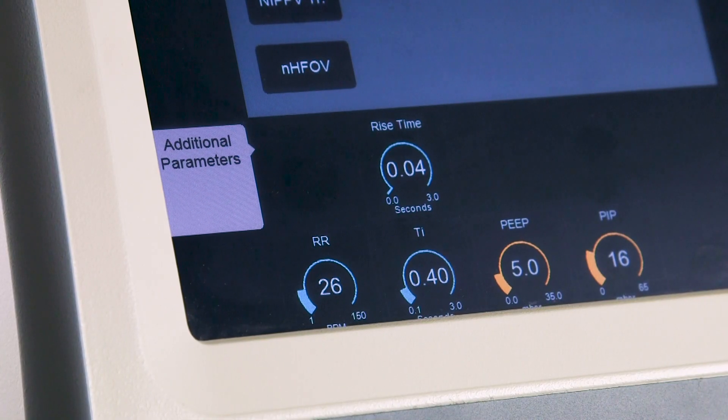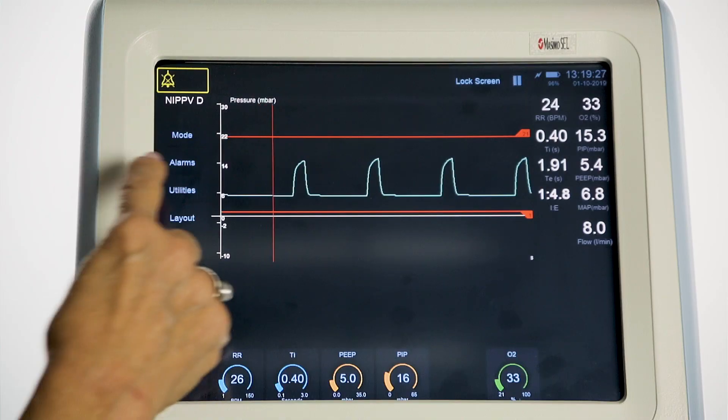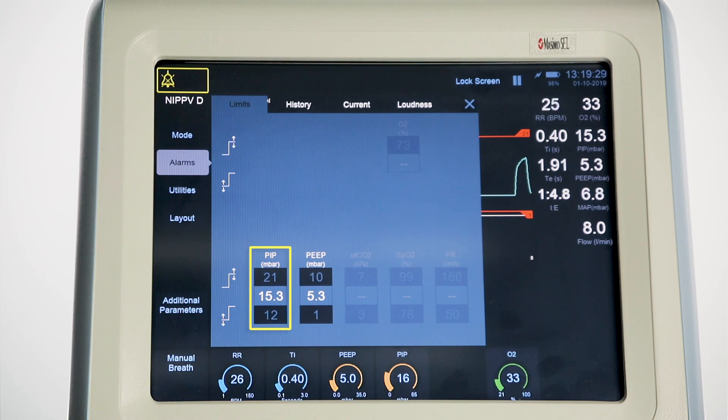The user can also set an additional parameter which is displayed when the mode is first selected: rise time, the time to reach the PIP for manual or backup breaths. Alarms include high and low PIP, and high and low PEEP.